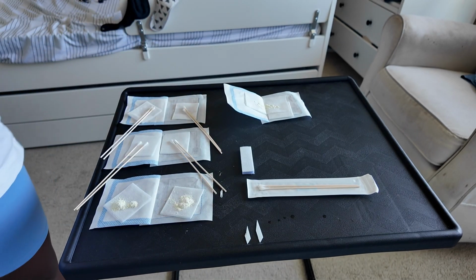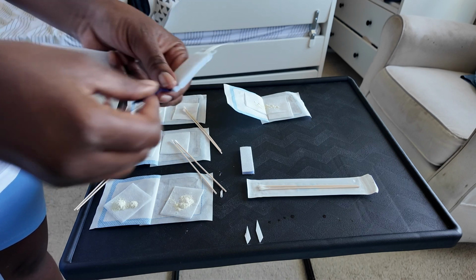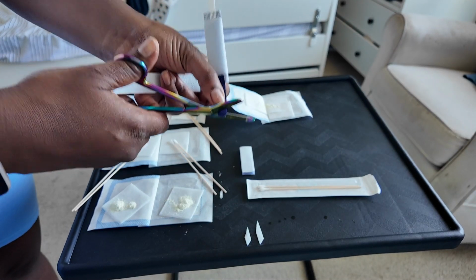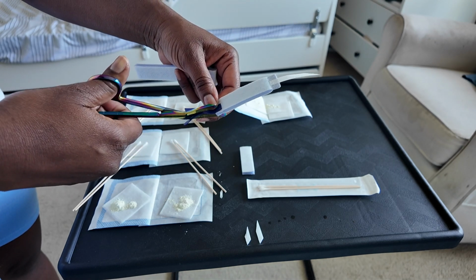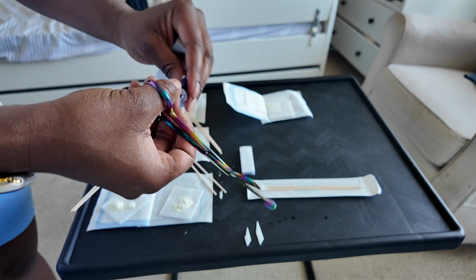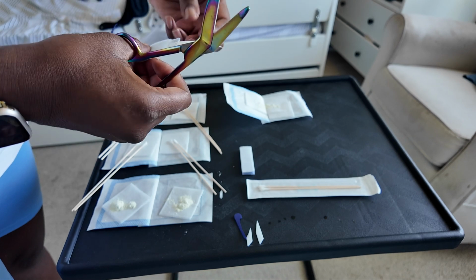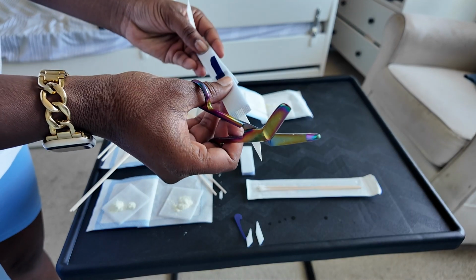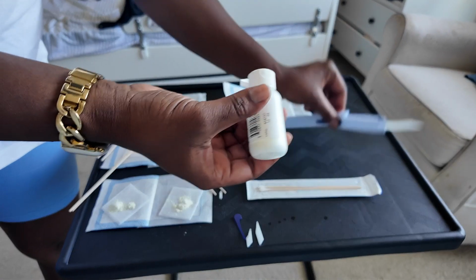I like to give myself a little bit of slack so it's not going to have any opening and expose her skin. It needs to cover her whole entire neck. Because she's got a small neck and these ties can be kind of thick and kind of cut into her skin, this blue part, I make it a little bit skinnier so it can sit right in the middle of the trach tie area right there and not rub on either side of her neck. If it's too thick, it seems to dig a little bit into it. Some people do it differently.